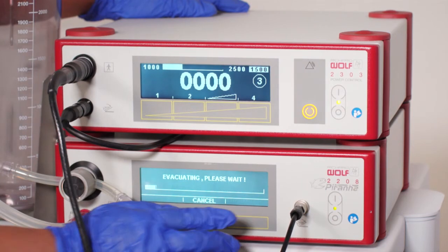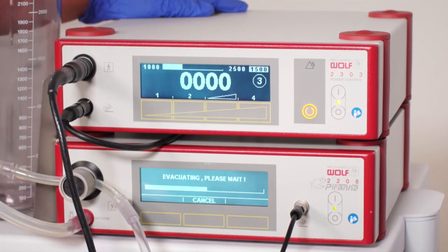The non-sterile team member may now press continue. The system will evacuate and must be allowed to do so completely, or the system will alarm.